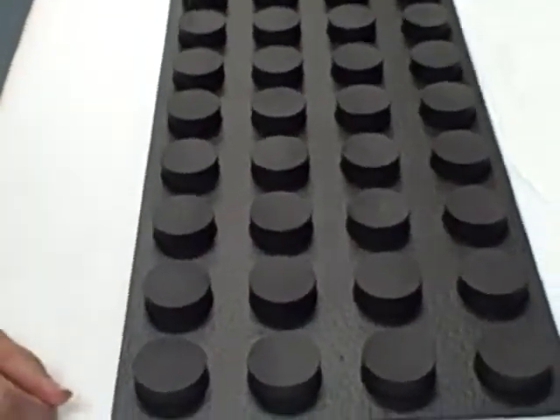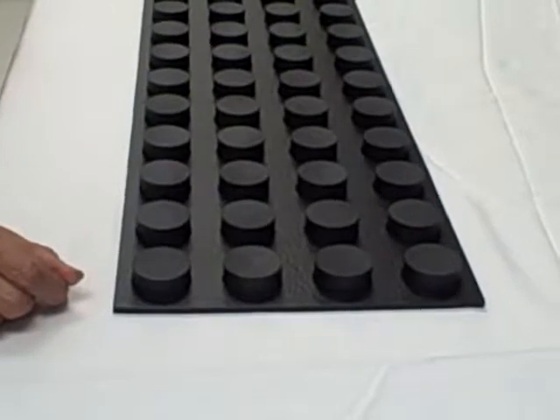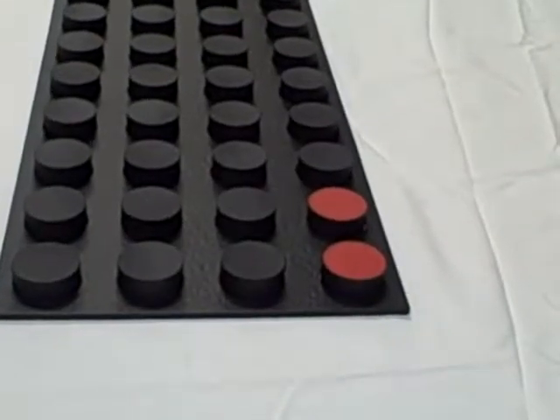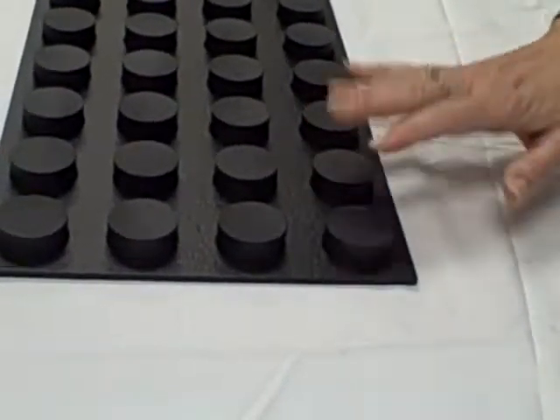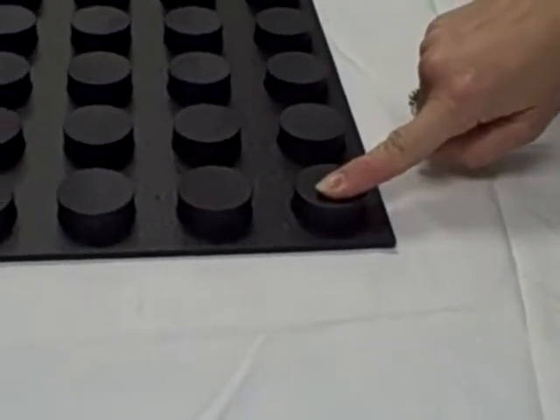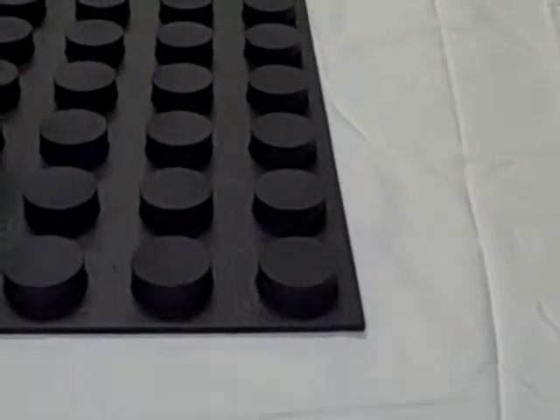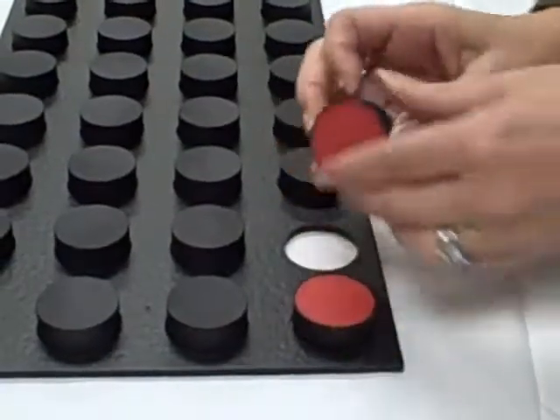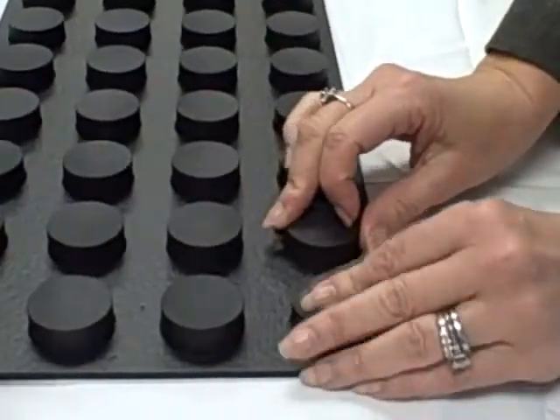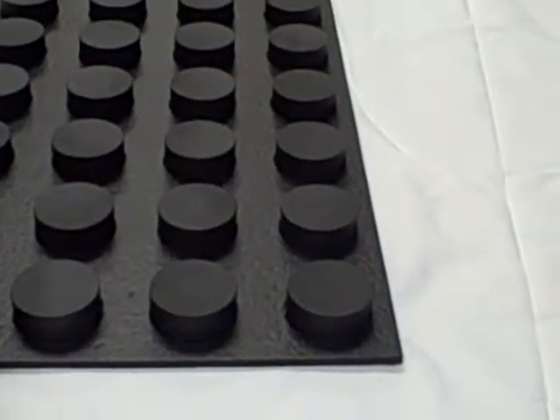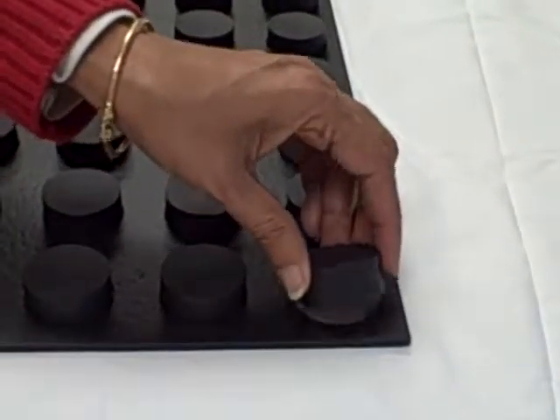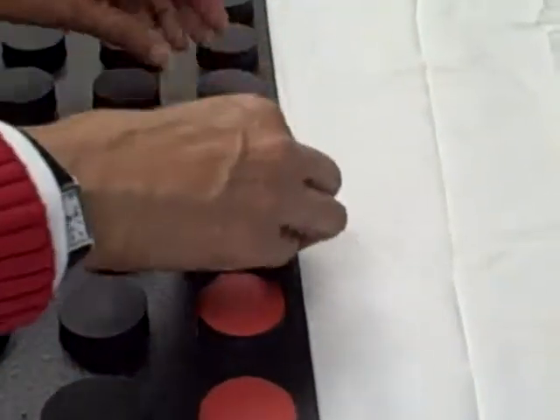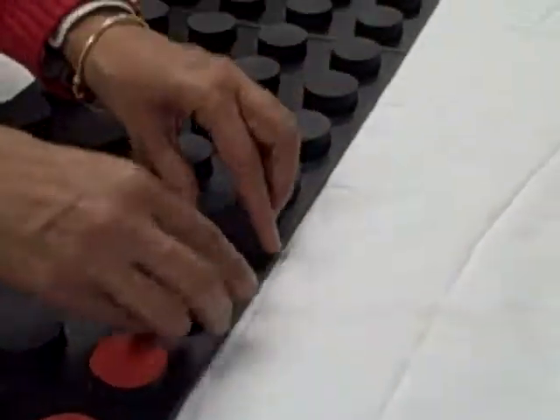And you would read your client the directions that say, the object is to see how fast you can turn the blocks over, like this. So with your left hand, you're going to start with the upper right hand hole. And actually, this is a two-handed test, so what they want you to do is turn it over like that. So pick it up with one. With your left hand, lift the block from the upper right hole, and with your right hand, put it back, bottom side up, into the same hole. Work to the left across the board, picking up the blocks with your left. So this is what's called the turning test.